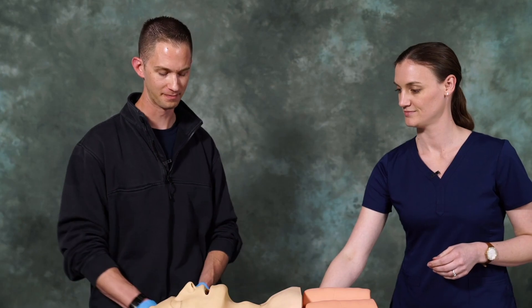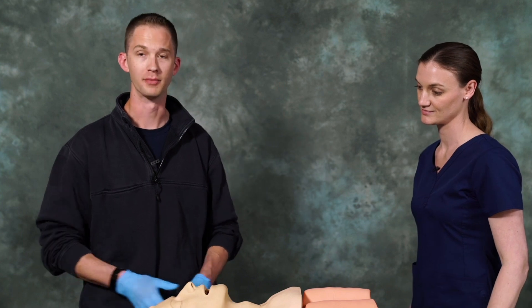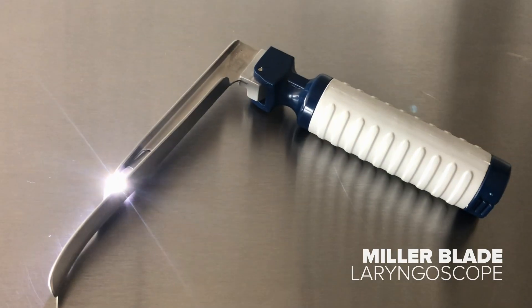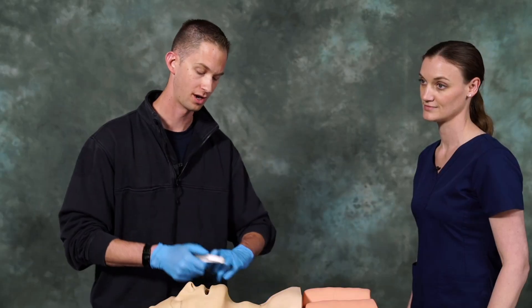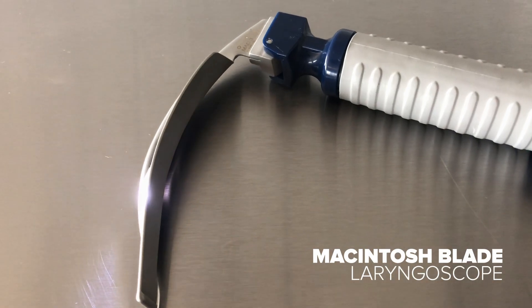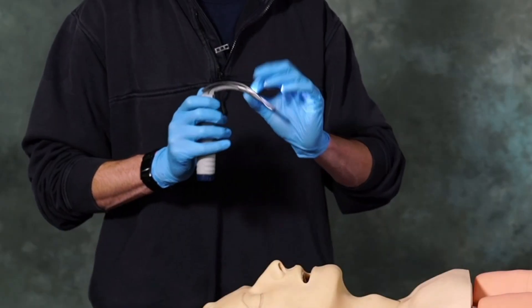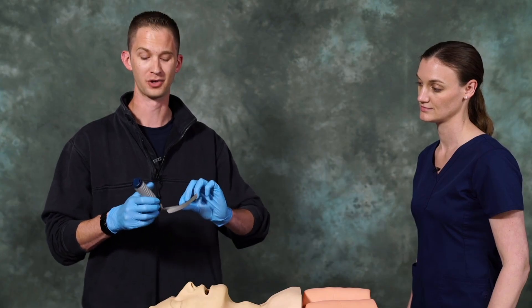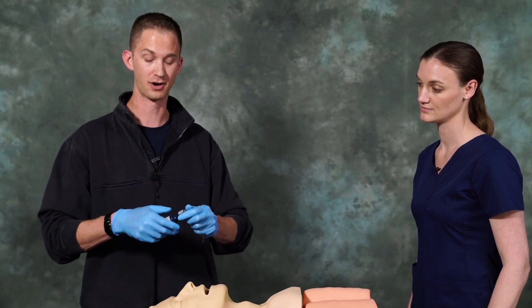Thank you, Rachel. In order for us to perform endotracheal intubation, we need to start off by checking our equipment. In this instance, we have two different types of blades: the Miller blade and the Macintosh blade. We want to ensure that we have a properly working light and that there are no dings, nicks, or dirt on our blades. We want to ensure that the hinge works very well and that we have a good battery within as well.